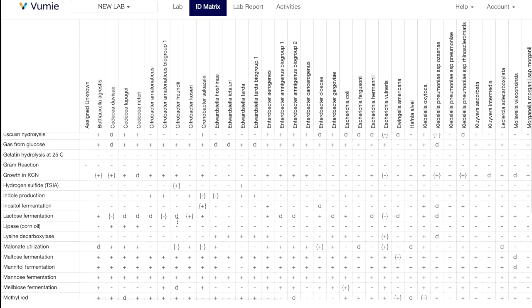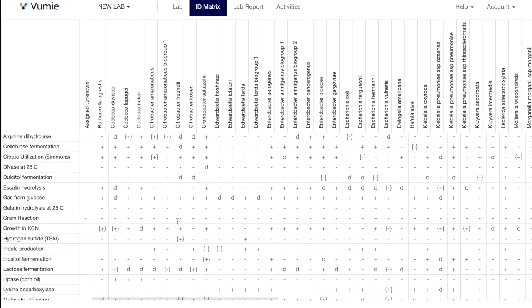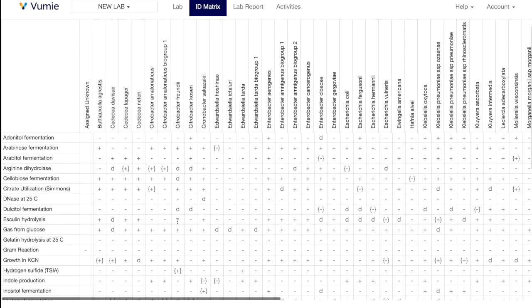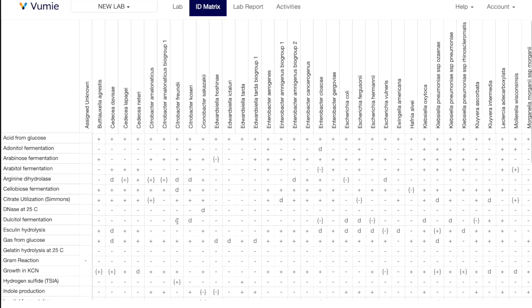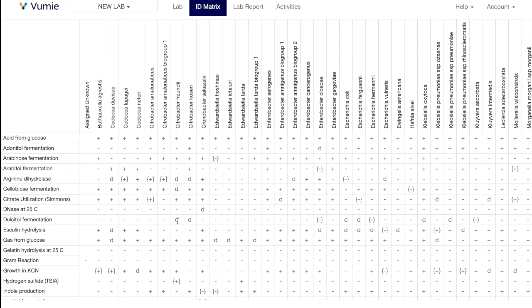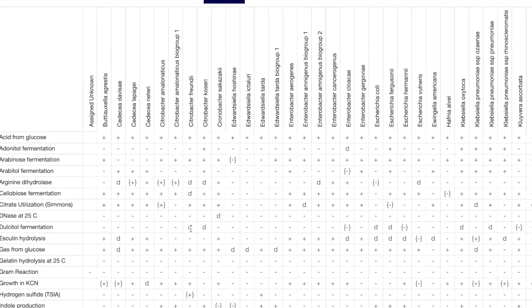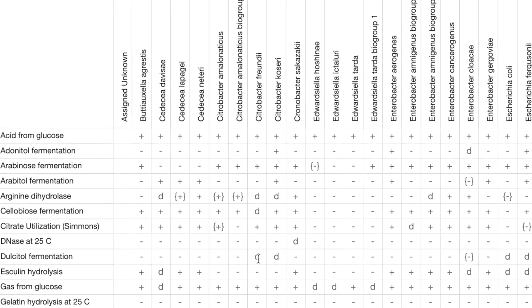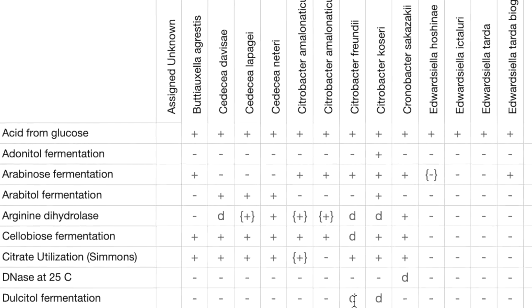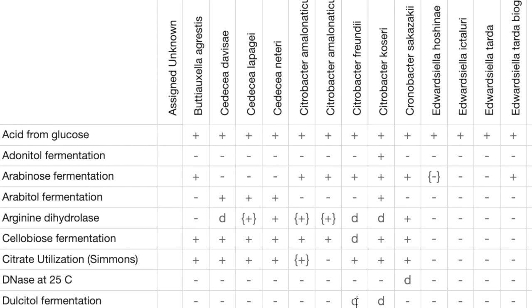Because of this variation within a species, an ID matrix often uses more than just positive or negative as possible results. In this matrix, these are the possible results and their meanings.